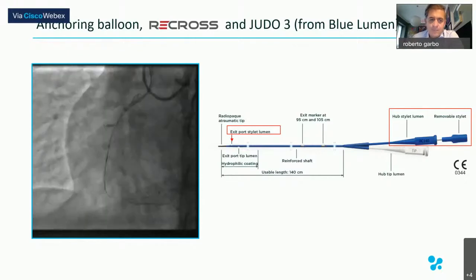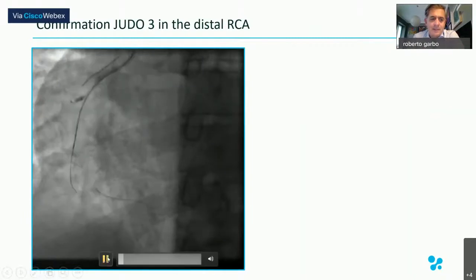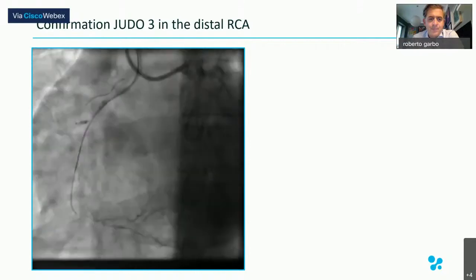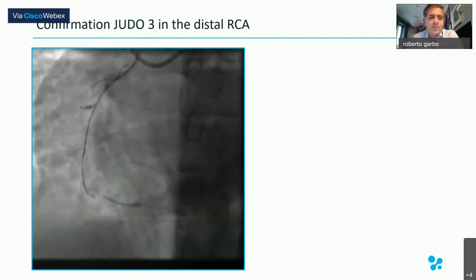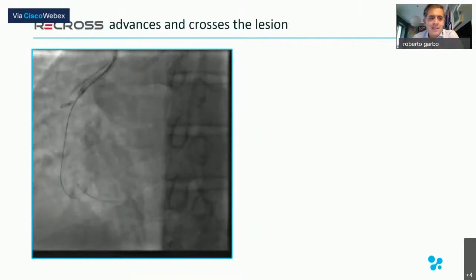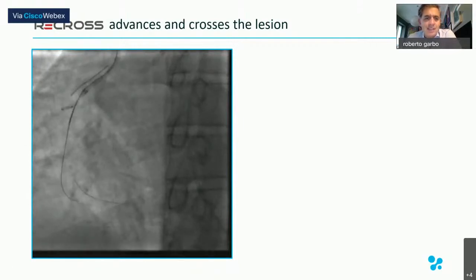Now we have a confirmation. You can see. Perfect. So we have Recross, anchoring, Judo, and then what's happened? So I stop here, and then Gabriele, what's after that? Which is your next step in this situation?